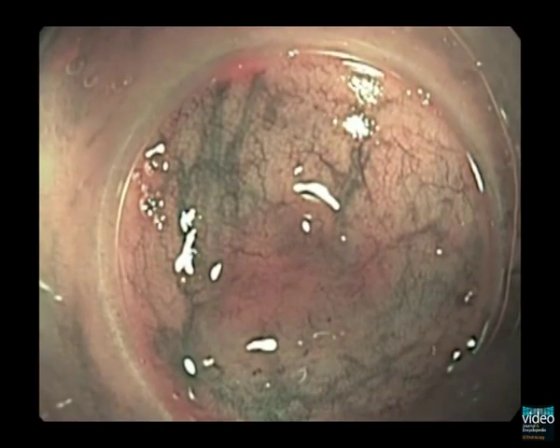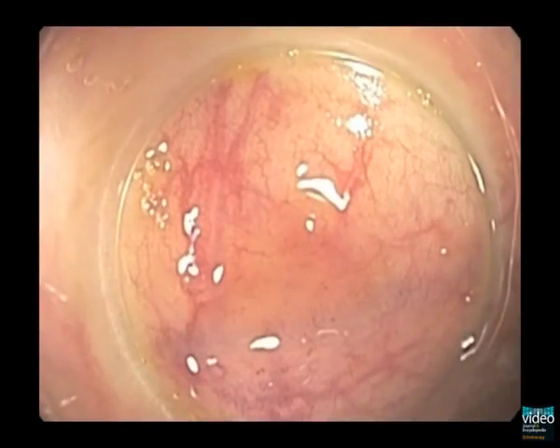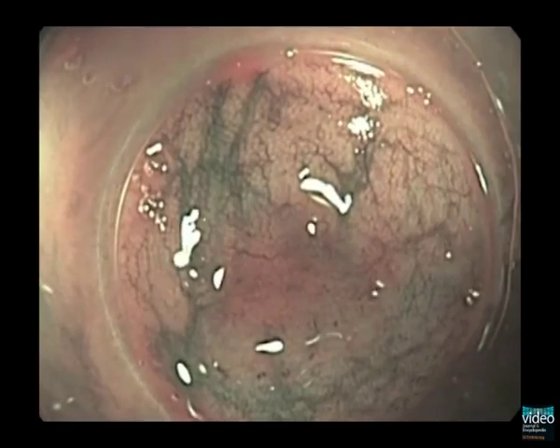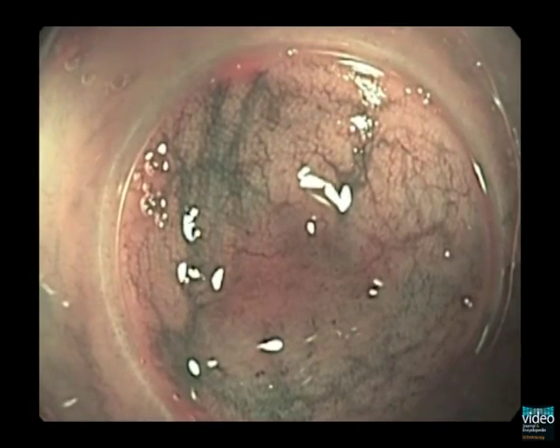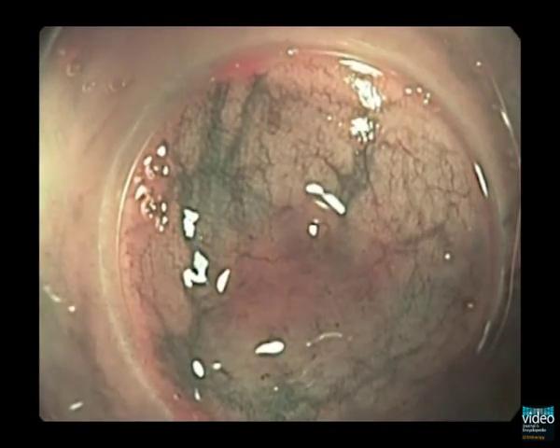We now apply confocal endomicroscopy to this lesion, utilizing the cap to stabilize the image. Again, notice the slight reddish or golden yellow pattern on the narrowband imaging suggesting overlying mucus. This raised suspicion for a serrated adenoma.